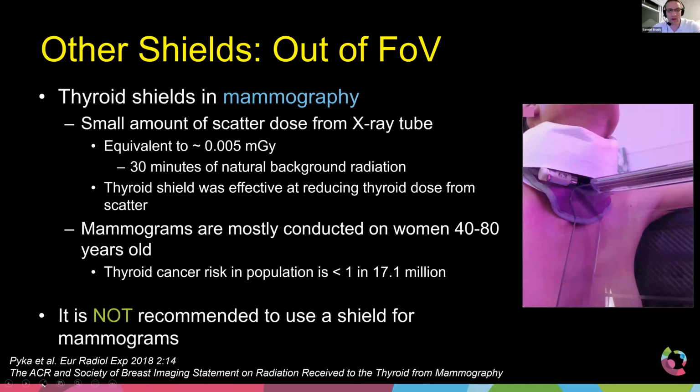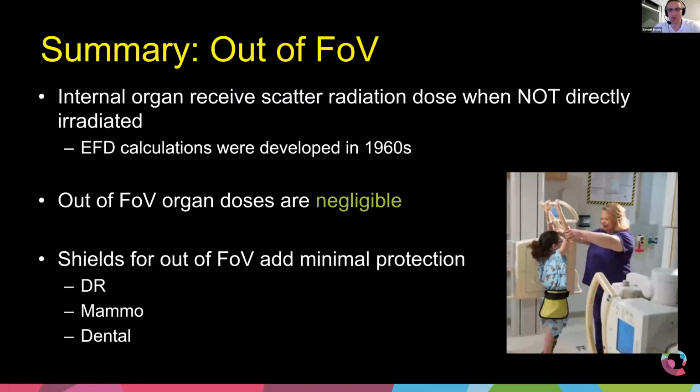And therefore, all of the various organizations, the ACR here in the US and the Society for Breast Imaging, all of these societies came out and said, no, you do not need to wear a thyroid shield when you're doing mammograms.